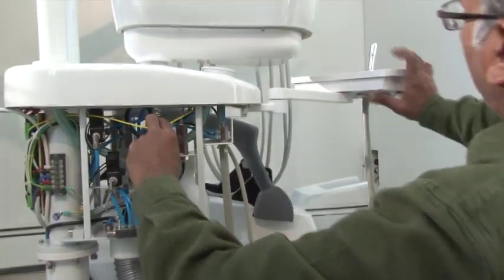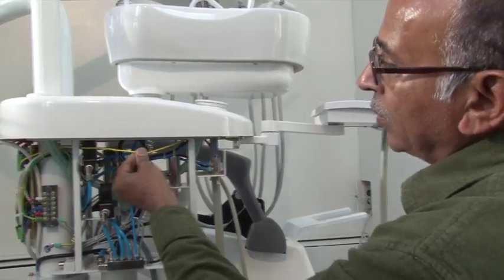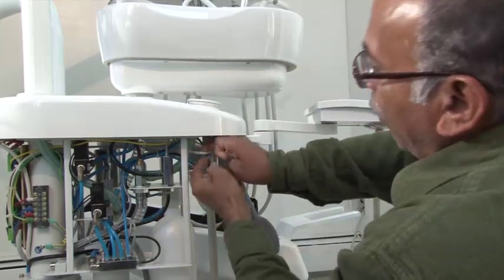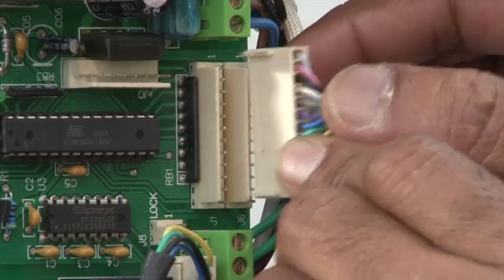If you wish to use the external suction, disconnect the two wires that come out of the assistant tray arm as shown. Now connect the wires and the tubing from the delivery tray.